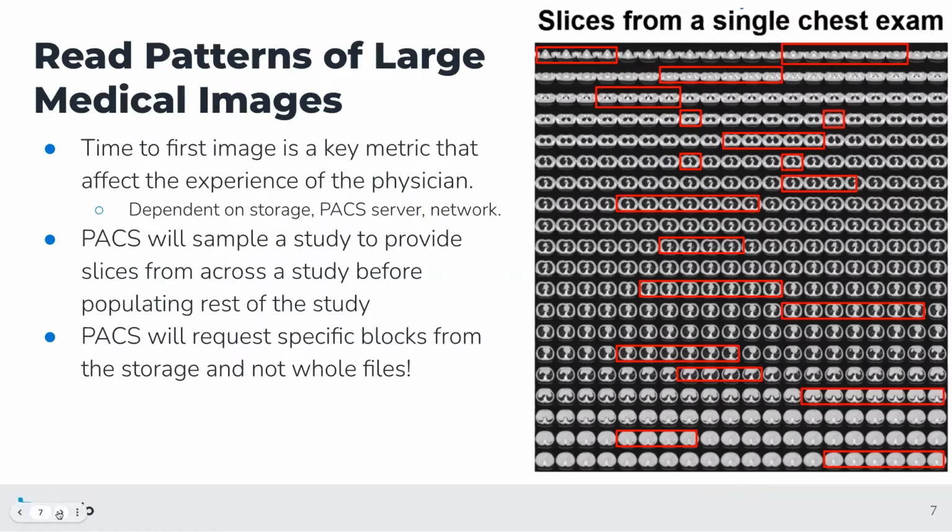Unfortunately, there have been a lot of chest x-rays in the last 2 years. And so, we are using this example. This is just a CT scan, and this is a simplified version. A CT scan is usually made out of tens, if not hundreds of slices, depending on the scan itself.